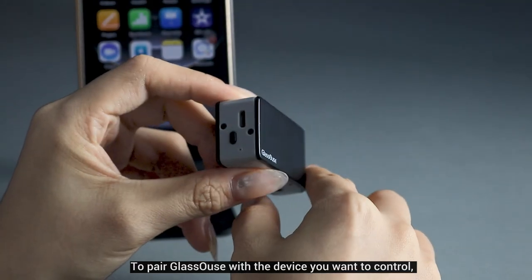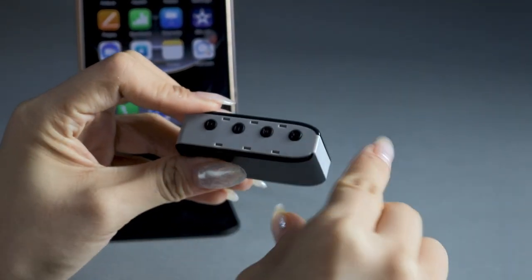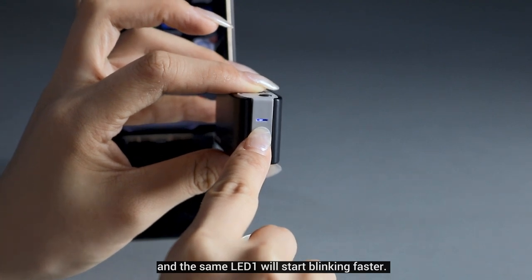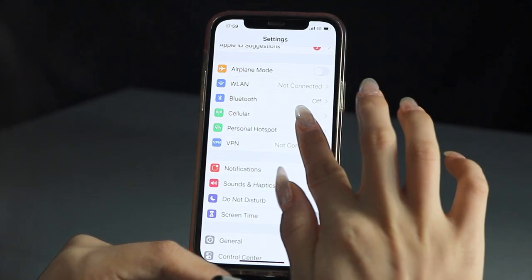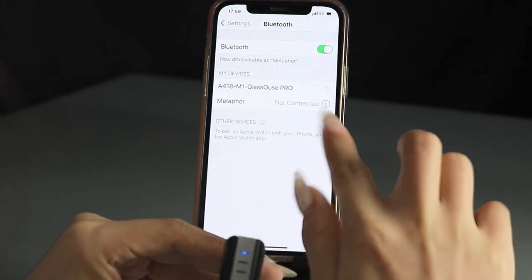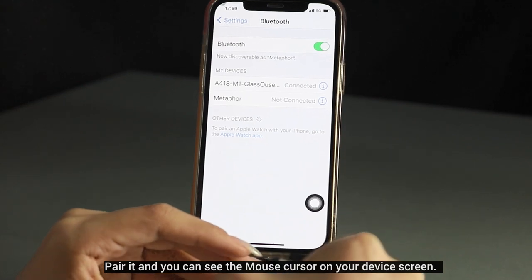To pair Glasses Pro with the device you want to control, press the power button to switch on Glasses. When you notice LED one light blinking, long press button B and the same LED one will start blinking faster. Switch on Bluetooth on your device and search Glasses Pro in the Bluetooth settings, then pair it and you can see the mouse cursor on your device screen.